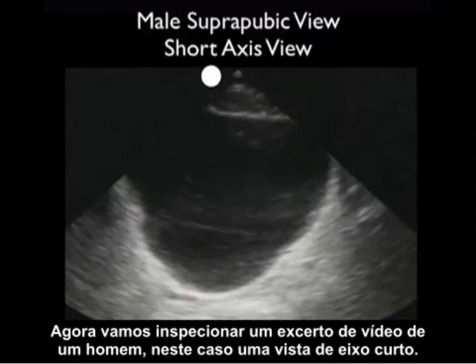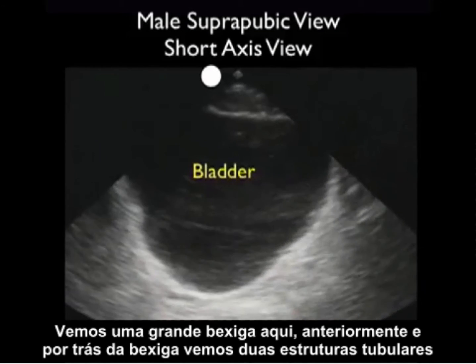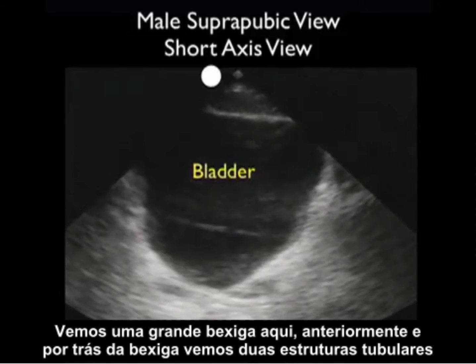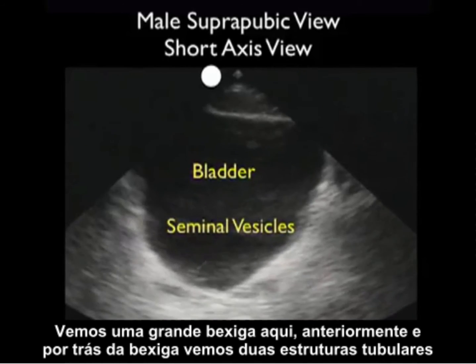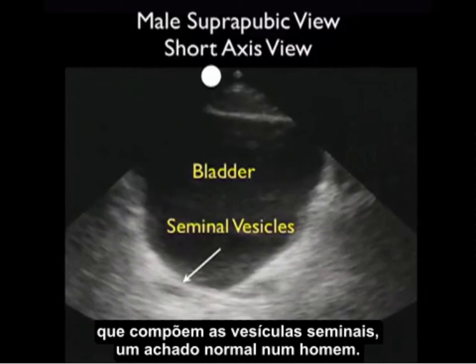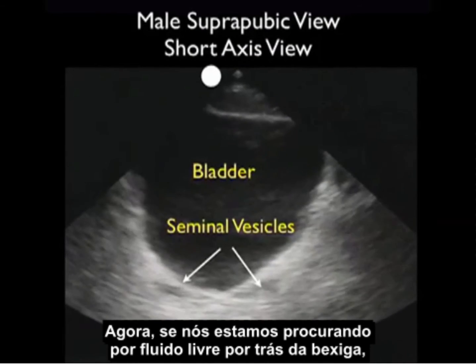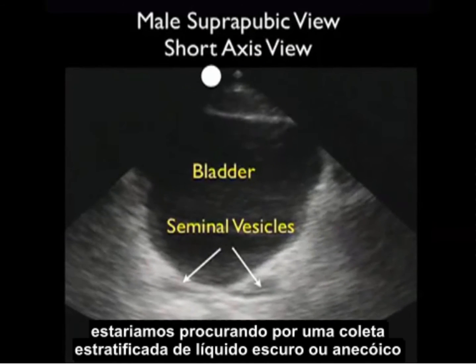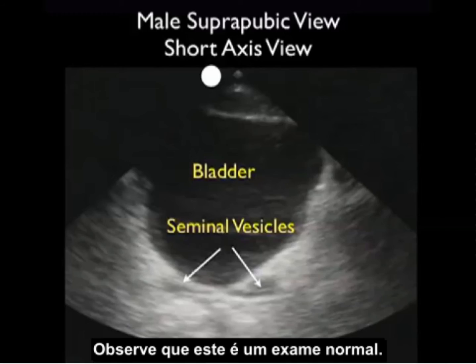Now let's inspect a video clip from a male — in this case a short axis view. We see a large bladder anteriorly, and behind the bladder we see two tubular structures making up the seminal vesicles, a normal finding in a male. If we're looking for free fluid behind the bladder we'd be looking for a dark or anechoic fluid collection layering out behind the bladder. Notice this is a normal examination.